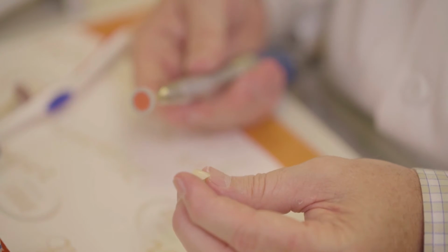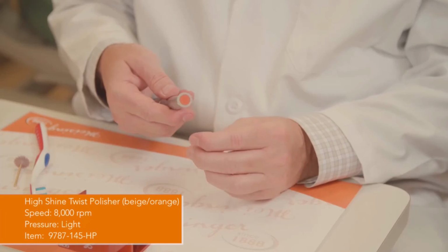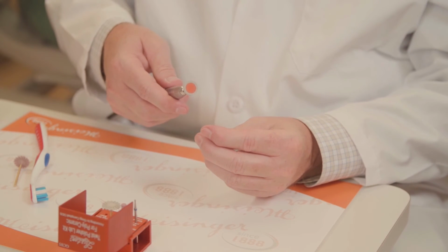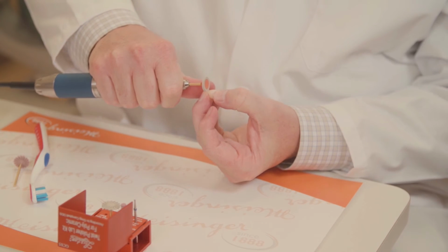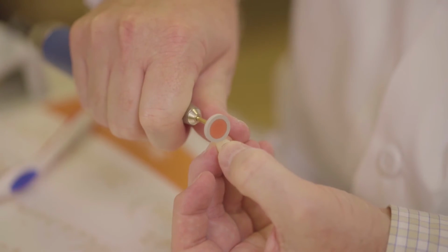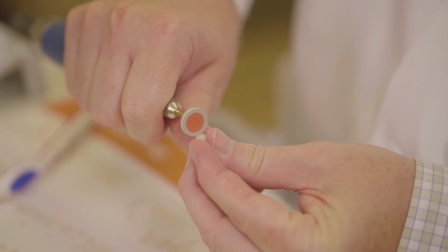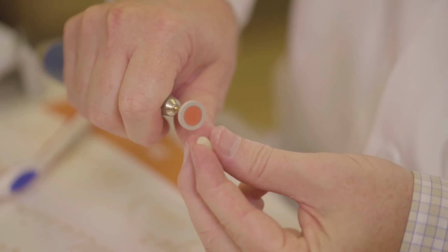So here we have a completed crown that's been polished, but if you just want to put a little extra pizzazz on it, that's why I added this to the kit. I use this for the Enamic, just to get a very high gloss on my line angles. So what I'm going to do is come in here and run this at about 8,000 RPM, and I'm just going to gently let this work for me and give a really beautiful polish here on any line angles that I have or any of my cusp tips. And again, this is going to give a very, very high gloss.